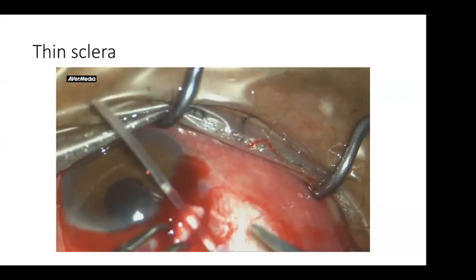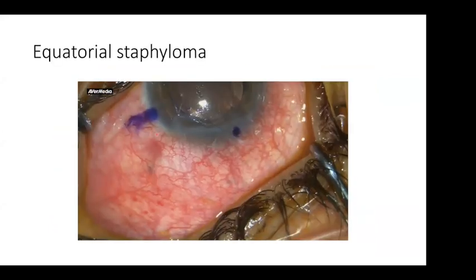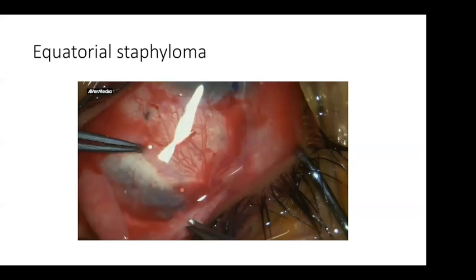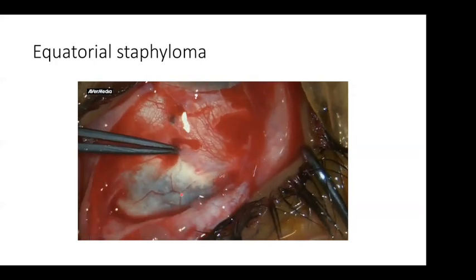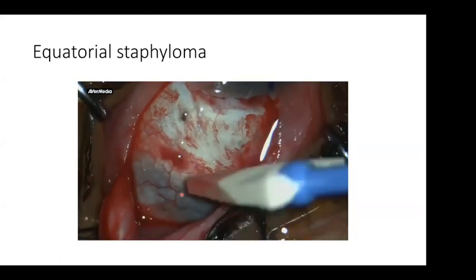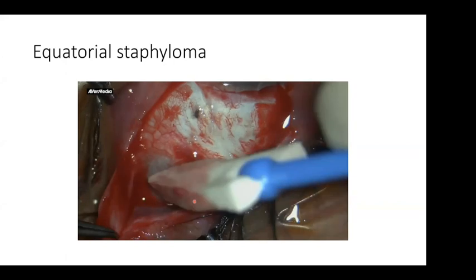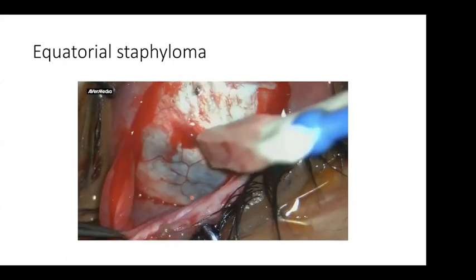Now, this is a more serious situation: a patient with an anterior chamber lens and everything is normal. The conjunctiva looks very redundant, good conjunctiva, but look at the sclera, you have a surprise. So when you do the valves, you can have some surprises like that. The patient preoperatively doesn't have any problem. There is no retinal detachment, there is no choroidal mass. But again, you can see something. This is a show of the ciliary body, that pigmentation in the episclera. It is a very frightening appearance to see that.